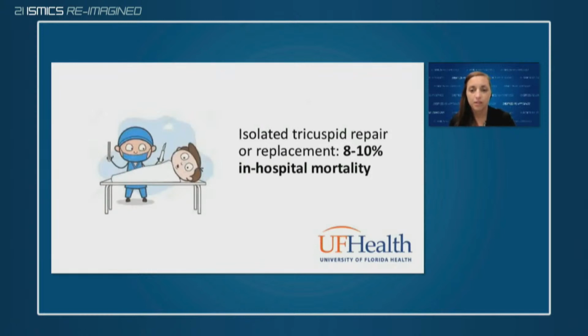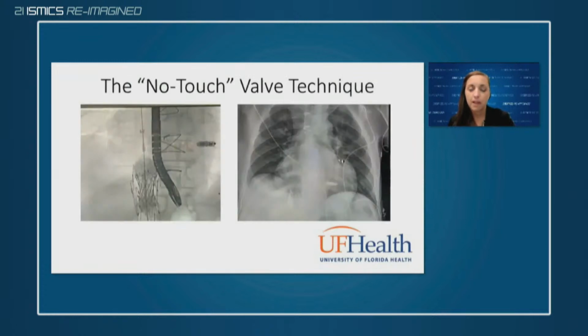In light of this, elderly or frail patients with severe TR and a prohibitively high perioperative risk are left with significantly decreased quality of life and few options other than medical management. The no-touch valve technique is presented as a compassionate technique for patients with prohibitive surgical risk and severe TR in the setting of intracardiac leads.